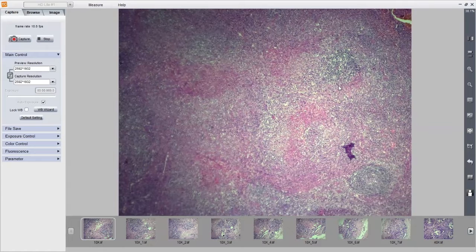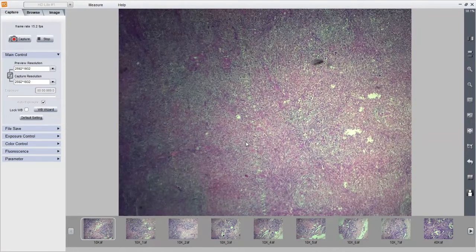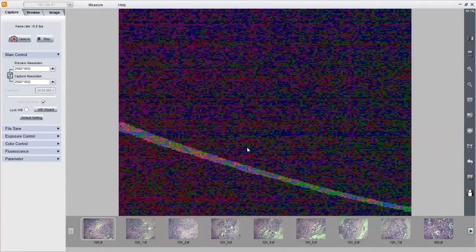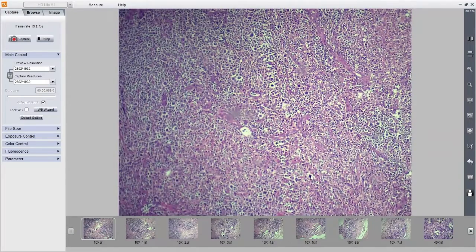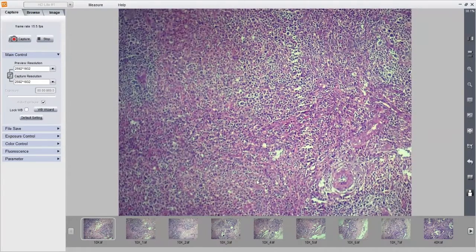Can you see these cells? Very dark cells, which are projecting out here in this scanner view? Yes, this one. I'll show you in high power. This is 10x. These cells, mummified looking cells. This one. Here. In the background, maybe some myeloid cells are there, which are eosinophils, I guess, some eosinophils.